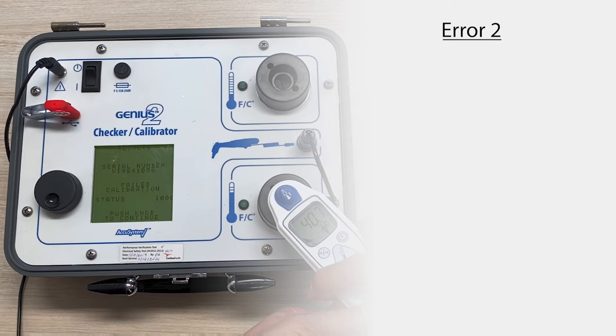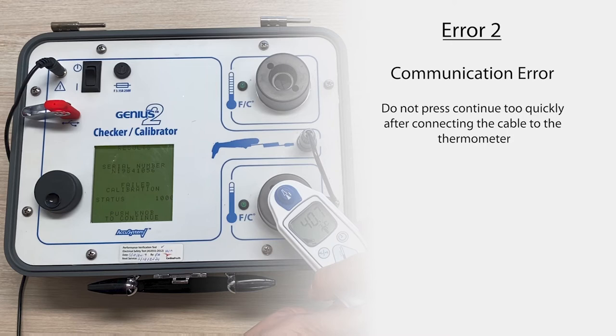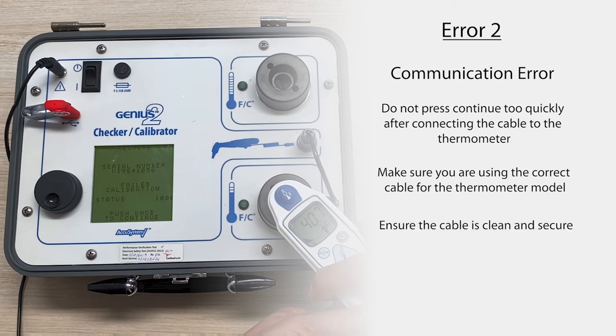If you're getting error 2, also known as the communication error, this is usually to do with the connection to the cable. The most common fix is making sure you don't press continue too quickly after connecting the cable and pressing the scan button. You need to give it enough time to establish communications before continuing. Also make sure you're using the right cable for the right thermometer model and that it's clean and secure. You can clean the pins of the cable connector or pads of the thermometer board with a cotton swab dipped in alcohol — allow the alcohol to evaporate fully before continuing. If you're still getting error 2, switch off the calibrator for a minimum of five seconds and then switch it back on. Don't worry about waiting the 15 minutes again as it's already acclimated to the room temperature.